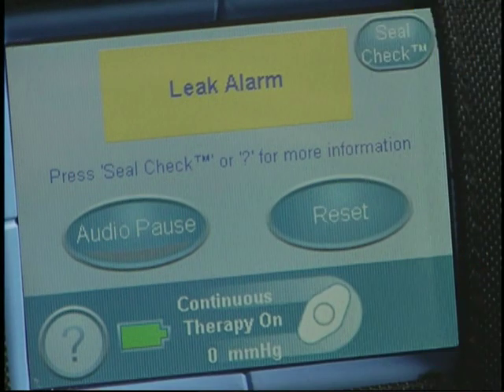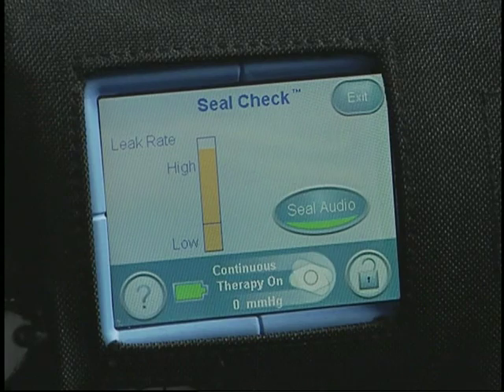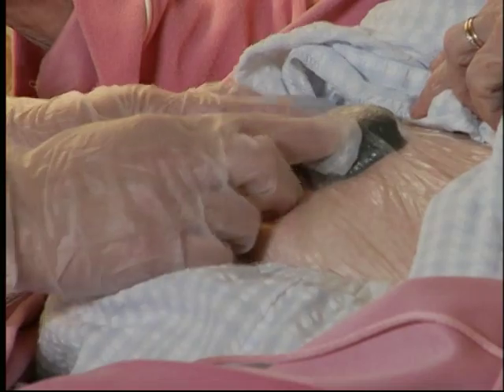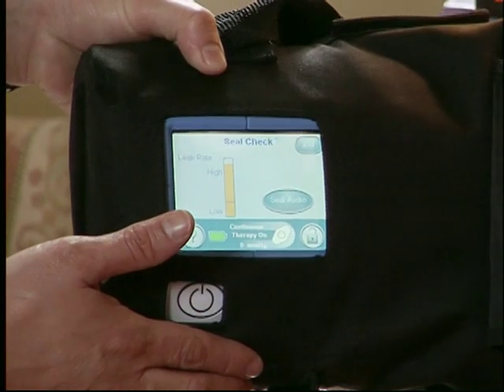A special feature will alert you to any leaks. SealCheck will help identify and find a negative pressure leak. If a significant leak is present, the SealCheck tool will help you find the location of the leak. The height of the bar graph and the frequency of the audible tone will reflect the leak rate.